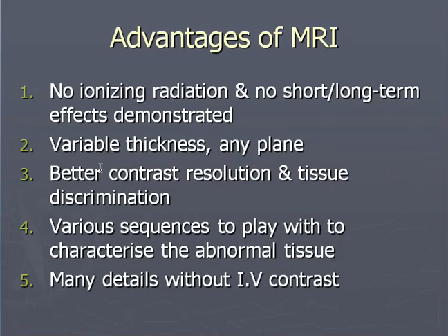Advantages of MRI: no ionizing radiation and no short or long-term effects demonstrated. Variable thickness, any plane, better contrast resolution and tissue discrimination. Various sequences to play with to characterize the abnormal tissue. Many details without IV contrast. As we said, particularly in angiography and venography, we need not give the contrast to the patient. So this is non-invasive.